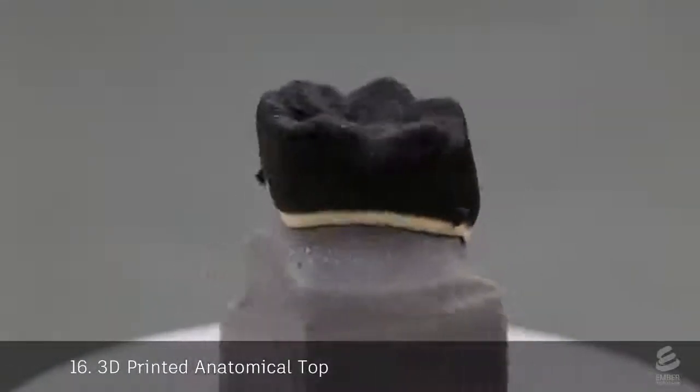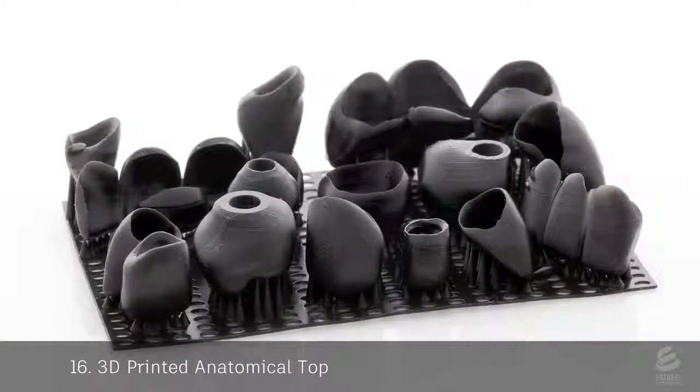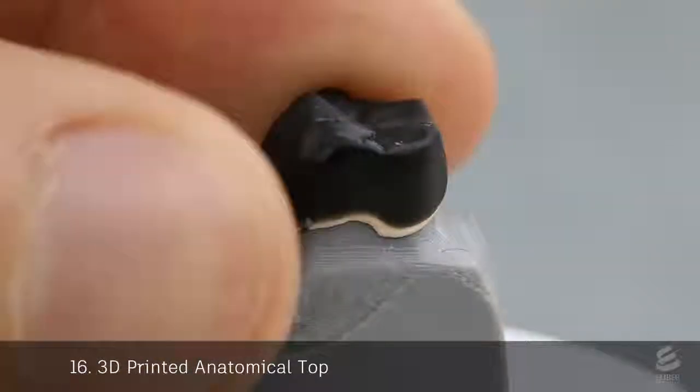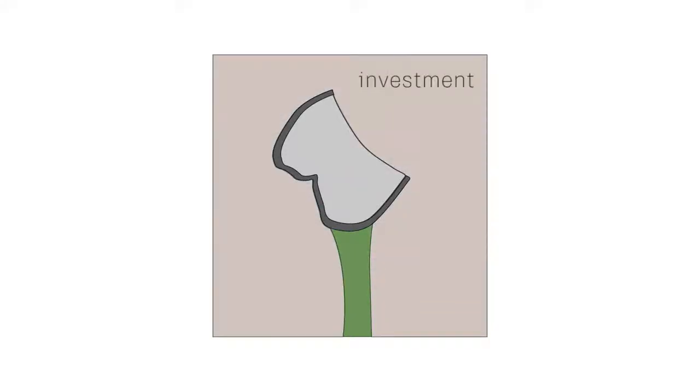To create the porcelain layer, an anatomical top is first 3D printed on Ember in castable resin. The top slides onto the opaque casting. The casting and top are then attached to a wax sprue.